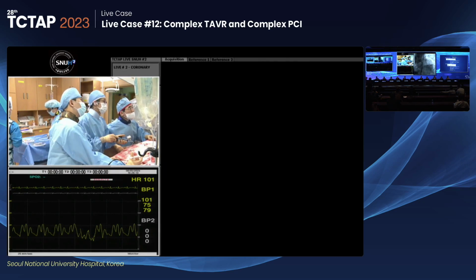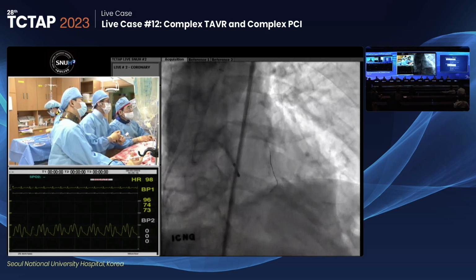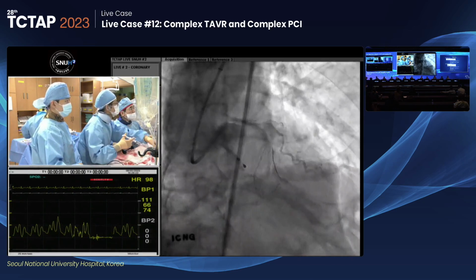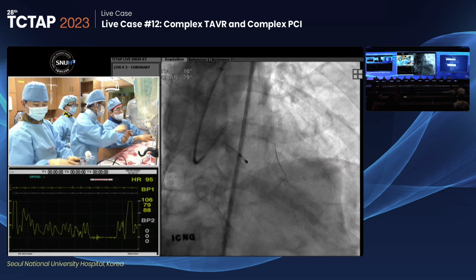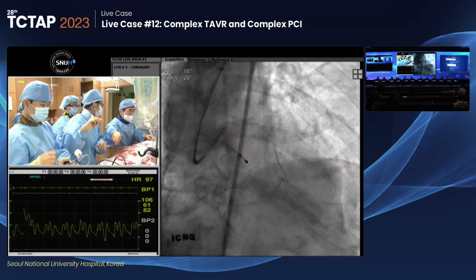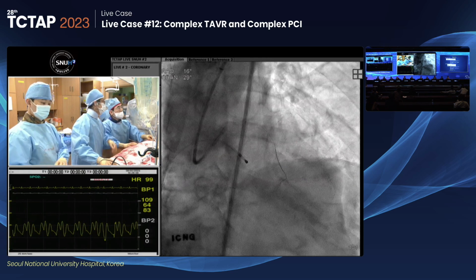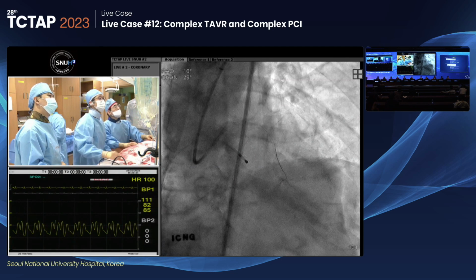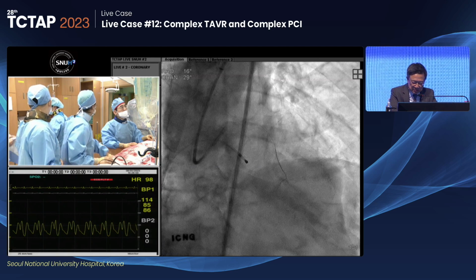He tried to open the proximal part first. Inflation. Yeah, opening the proximal part is not bad. At least you get some flow. Blood pressure is okay. Stent. What's the ejection fraction again? 25 earlier. 36. Worse after, before, but now improved a little bit. The microcatheter position in the left main was obstructive. I think it was causing ischemia. Just do something proximally first. Yeah, I think you should focus on the proximal. So many lesions, get rid of some resistance as best you can.